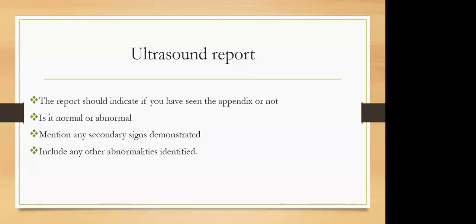Okay, the ultrasound report. When the surgeon sends the patient to us to do the scan, they are waiting for us to give them the answers, and our answers should be accurate and straightforward.